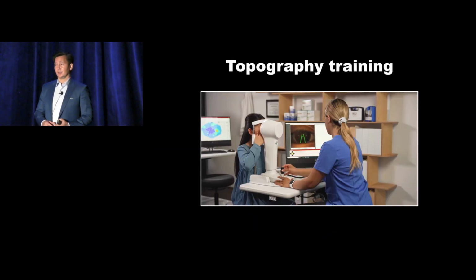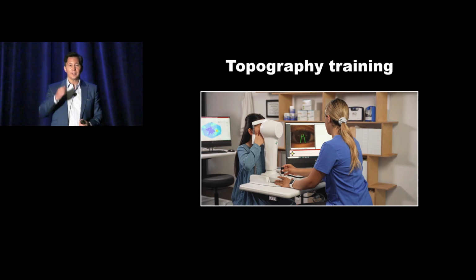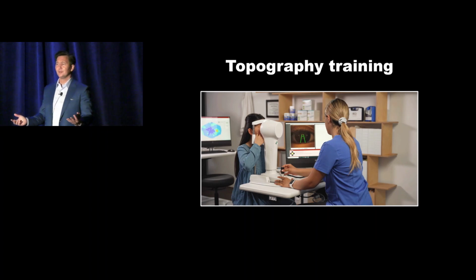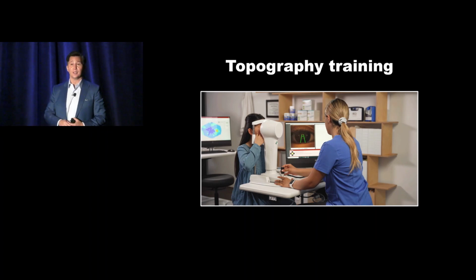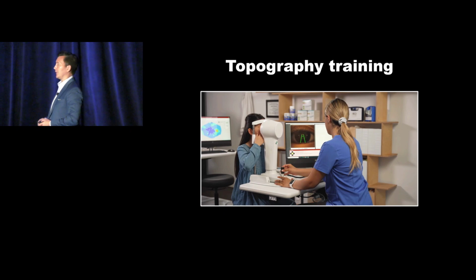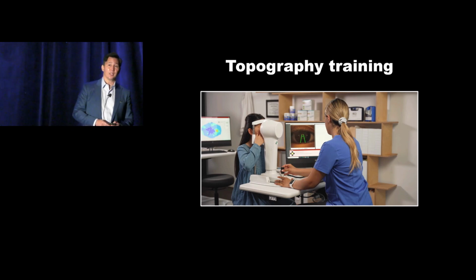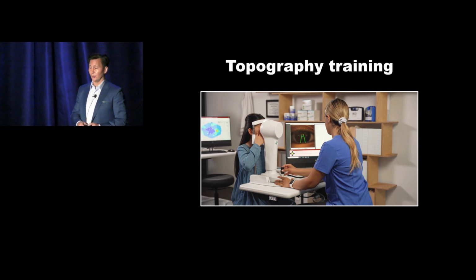Train your staff. That's such an important one. Whoever's doing that topography, make sure they understand how you can get that fissure size open. There's tricks to doing it. Simply just chin forward, forehead back, pulling down on the cheek. That gives you a little more information, and you're not touching the upper lid. If you can, pull back the upper lid and lower lid at the same time if you need to, if you've got a small fissure patient, any little thing that can help you get more data, because you need that steep axis, you need the vertical meridian to understand what toricity you need in the construction of the lens. So not just the horizontal matters, both matter.